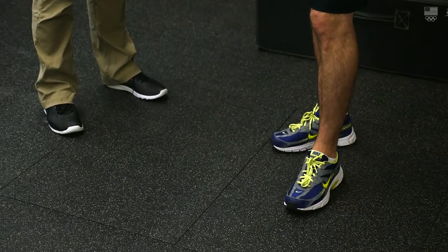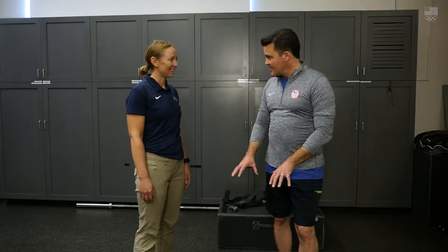Julia, thank you so much for taking time to be with us today. So much cool equipment in here. But this area right here is kind of freaking me out — this looks like we're standing on a trap door. What is this thing and what are we going to do?